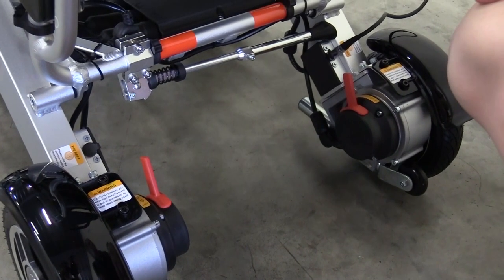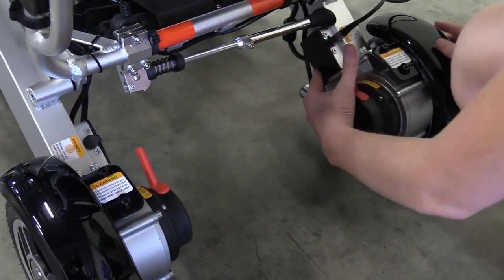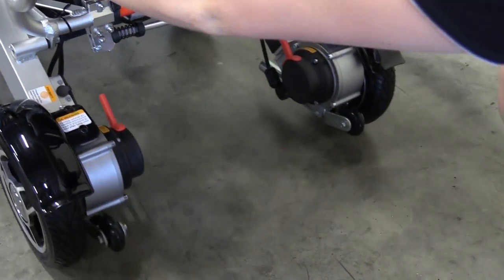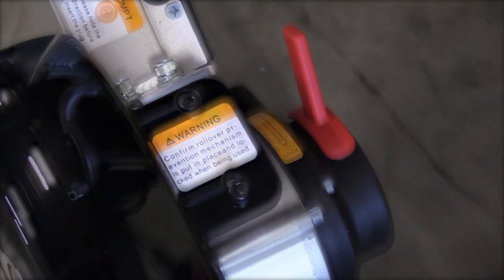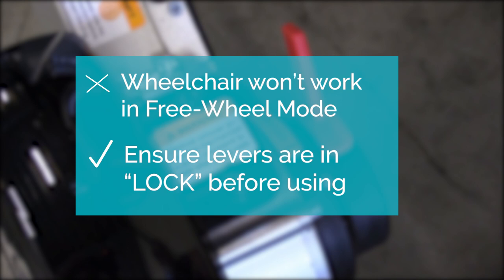To activate freewheel mode on your wheelchair, locate the red levers at the back of the wheelchair. To freewheel, push the lever up on both sides — this means you'll be able to push your wheelchair manually. To take it off, simply push the lever down on both sides. It is important to note that your wheelchair will not work if you are in freewheel mode. Make sure the levers are in the lock position before attempting to use your wheelchair.